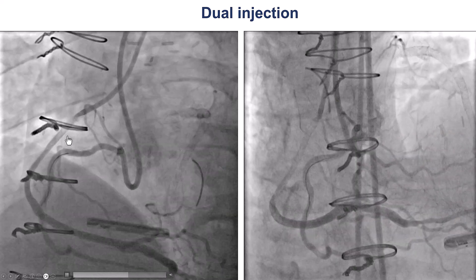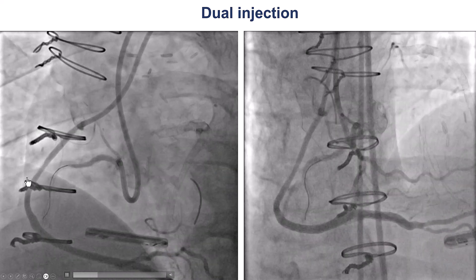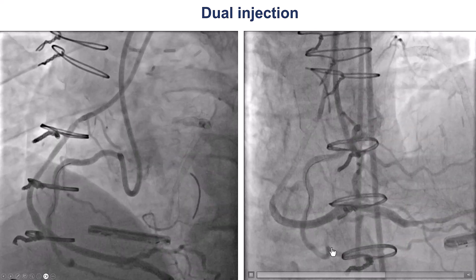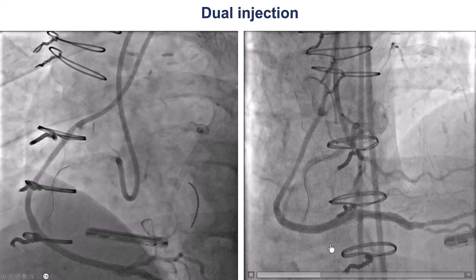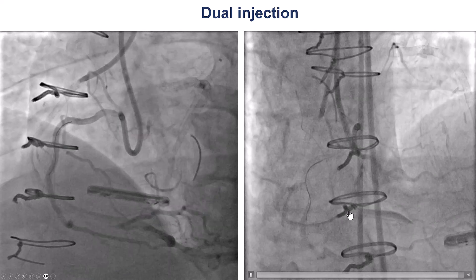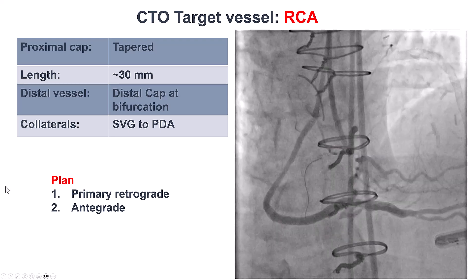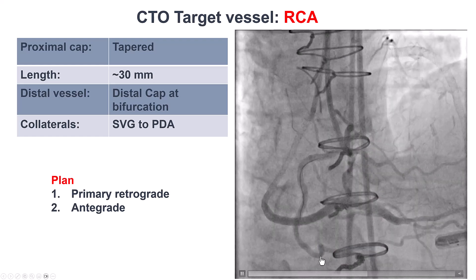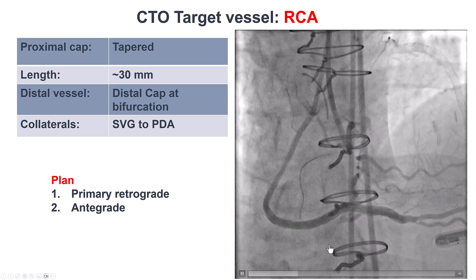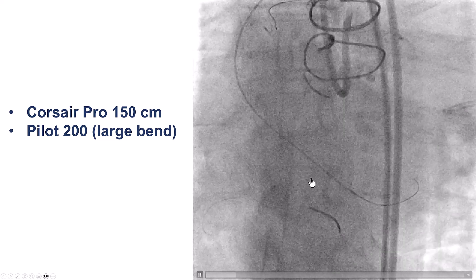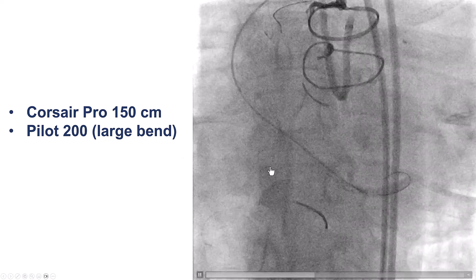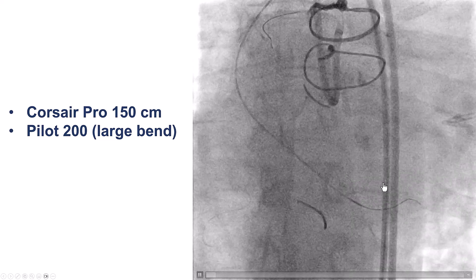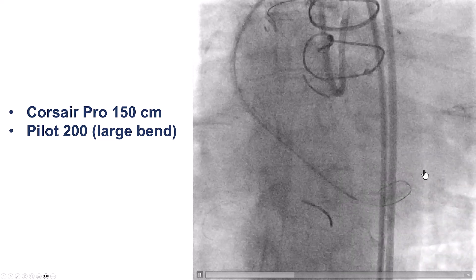On the day of the procedure, we ballooned the saphenous vein graft to restore some flow, so we have injection from the vein graft first, and then injection from the native right coronary artery. As discussed before, we can see a nub coming off at the proximal cap where the acute marginal takes off, and we see a bifurcation at the distal cap. Based on this, we decided to use a primary retrograde approach because of the calcium inside the occlusion, and also because this branch would be difficult to avoid with the wire. So we used a long, large microcatheter — Corsair — with a Pilot 200. The Pilot 200 is very useful for taking big bends like this, with an 80-degree bend; it has a parabolic grind and is less likely to prolapse into the other vessel.